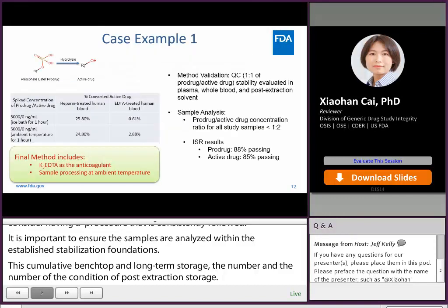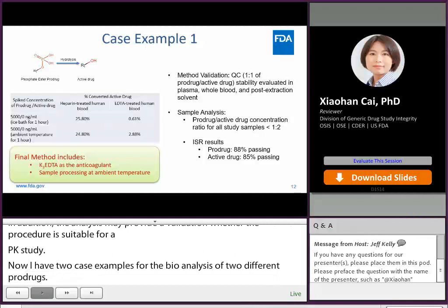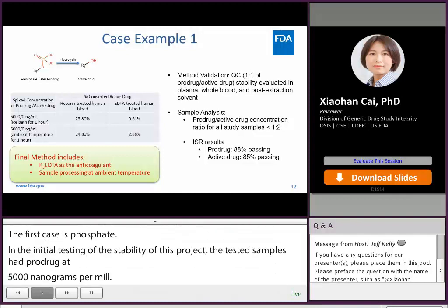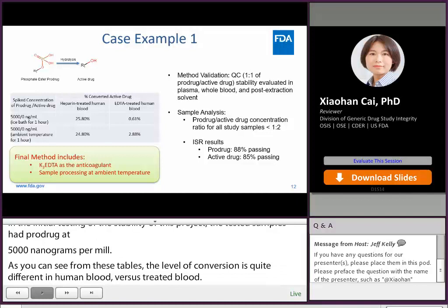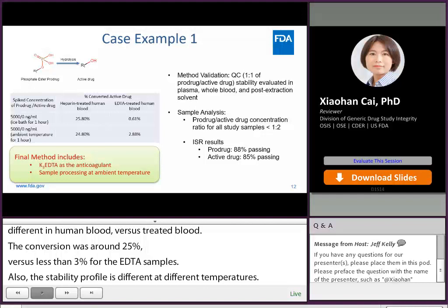Now I have two case examples for the bioanalysis of two different pro-drugs. The first case is on a phosphate ester pro-drug. In the initial stability testing, samples had pro-drug at 5,000 ng/mL alone, and both analytes were quantified to monitor concentration change. As you can see from this table, the level of conversion was quite different in sodium heparin-treated human blood versus EDTA-treated blood. For heparin-treated samples, conversion was around 25%, versus less than 3% for EDTA samples. Also, the stability profile differed at different temperatures — samples stored in an ice bath had less conversion compared to those stored at room temperature.